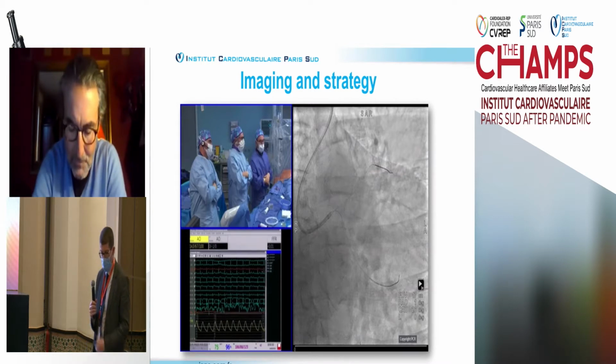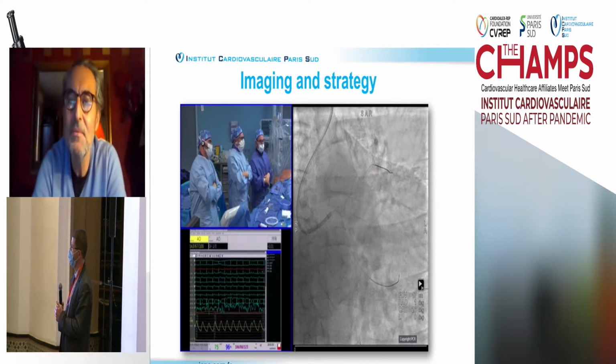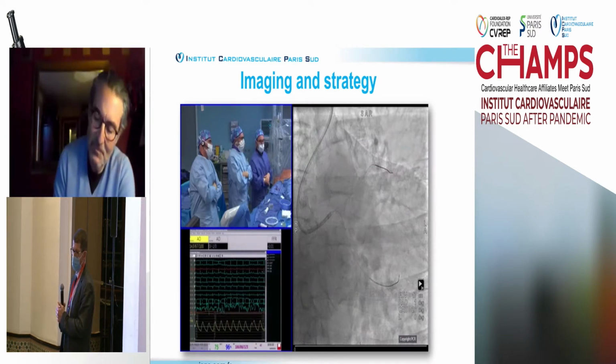because I will not keep, park the stent only in the ostium of the LAD. Without an IVUS, I think there is a lesion in this plaque distribution in the left main. So first of all, check the OM. Second, stent the diagonal. Third, make one stent from the LAD to the left main, POT, recrossing, kissing.